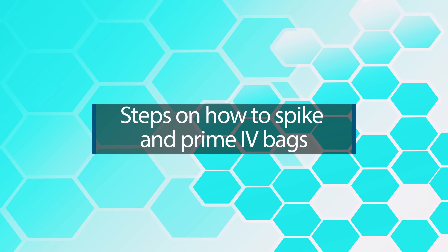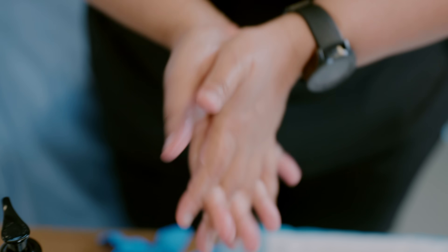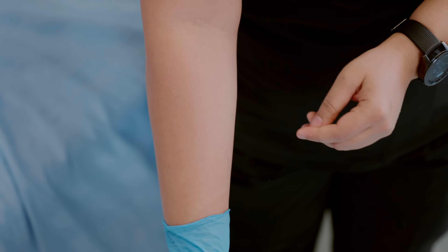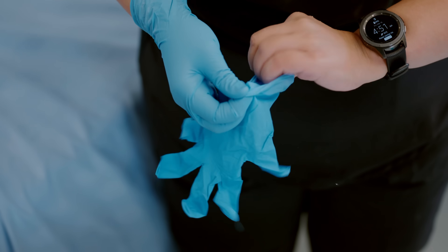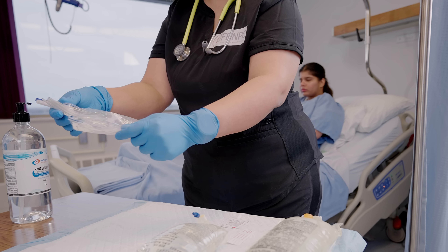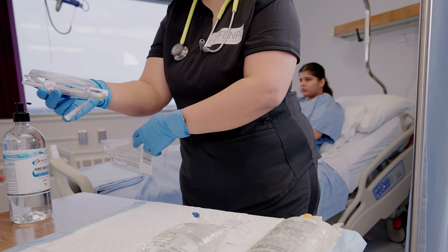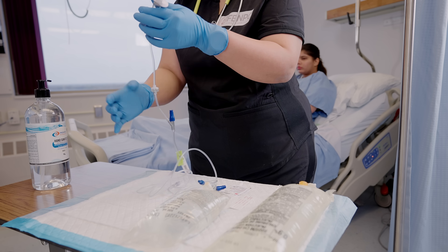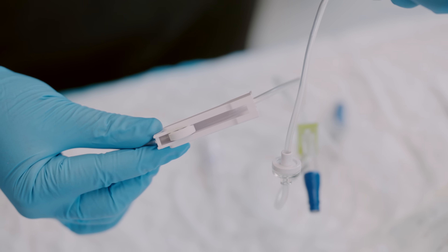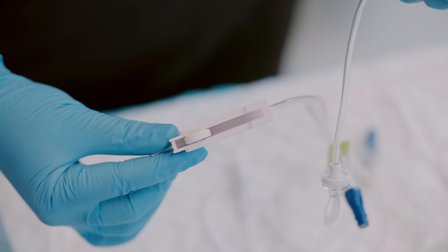Let's learn the steps on how to spike and prime an IV bag. Always wash your hands and wear clean gloves so you don't get contaminated with the medication while spiking or priming. Open your tubing package and unkink it, then roll the clamp to the closed position. This is very important — many nurses and IENs make a mistake here.